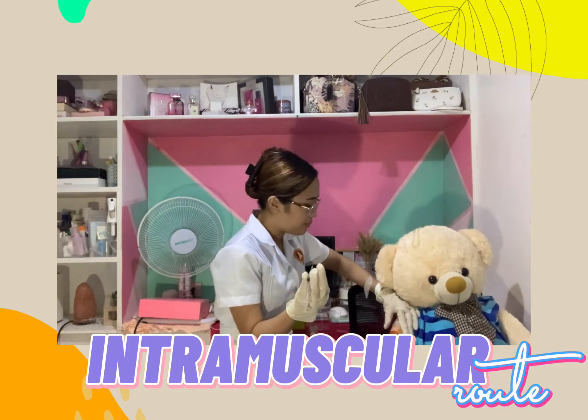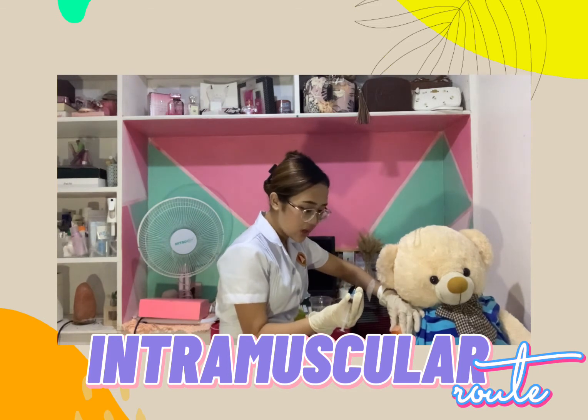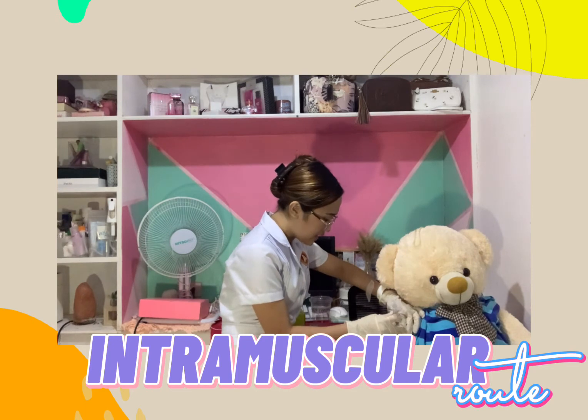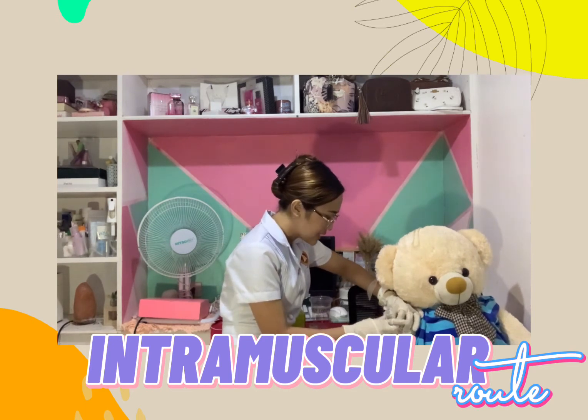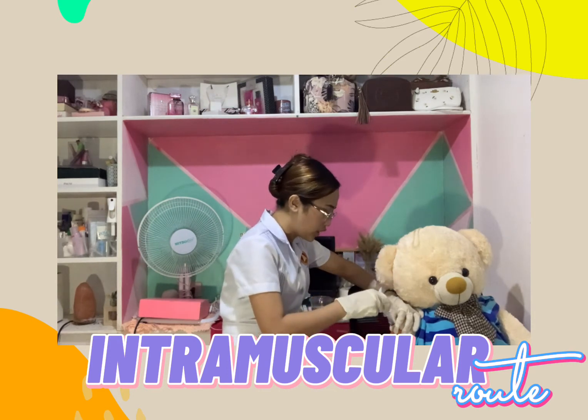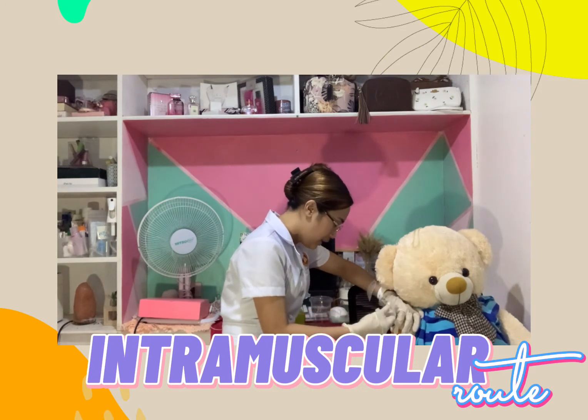So, while performing the Z-track motion or technique, we will now pierce the skin of the patient at 90 degrees. Slowly, smoothly, we will move our non-dominant hand onto the lower portion. We will move our dominant hand on the upper part of the syringe. We will aspirate the plunger. There is no blood, so we can slowly administer it. We will slowly administer it at 10 seconds per ml.